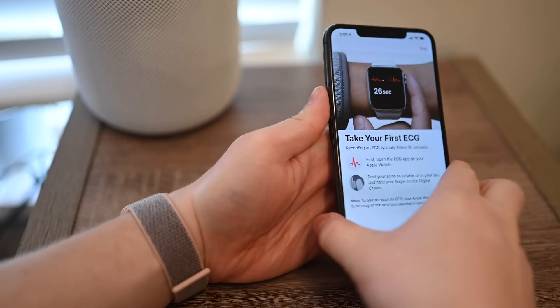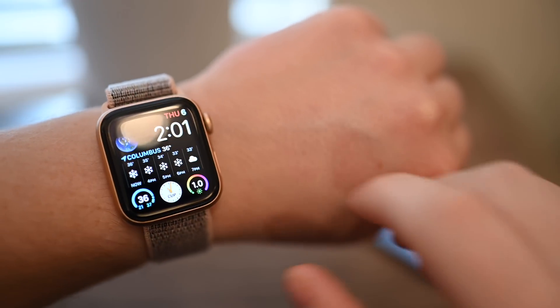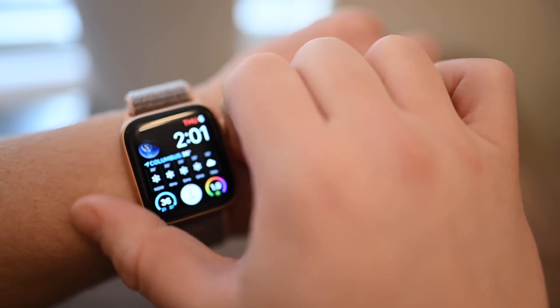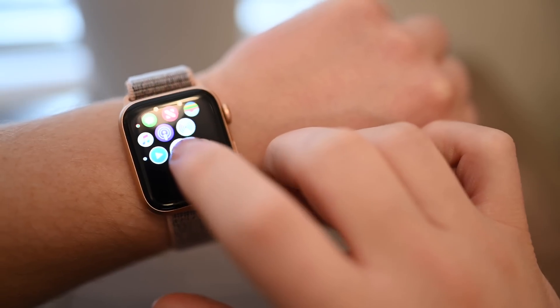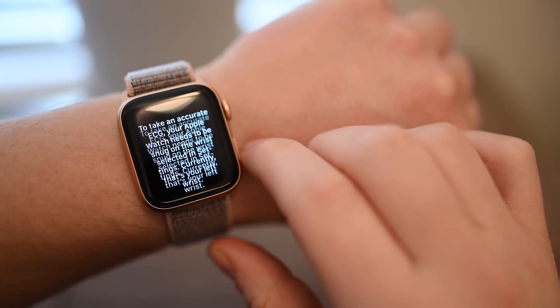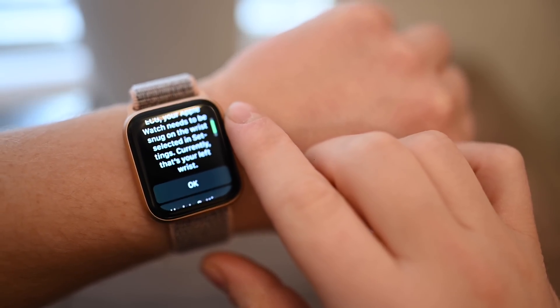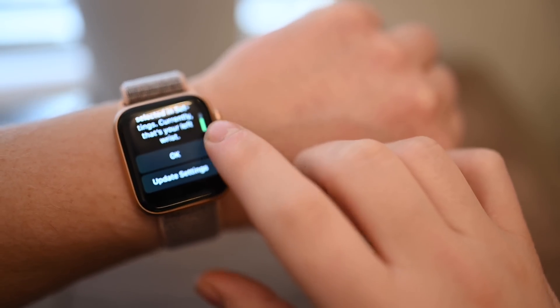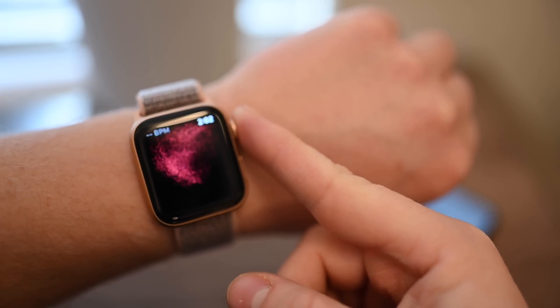Once you've gone through the prompts, it's time to take your first ECG. Return to your Apple Watch and open the ECG app. Instead of always having to go to the app directly, if you use it frequently you can set it up as a complication on your favorite Apple Watch face. Then make sure the Apple Watch is on the correct wrist — it just needs to line up with the selection you made in the settings app.